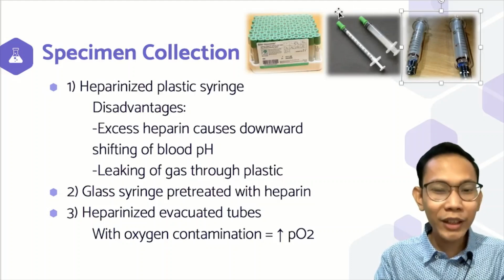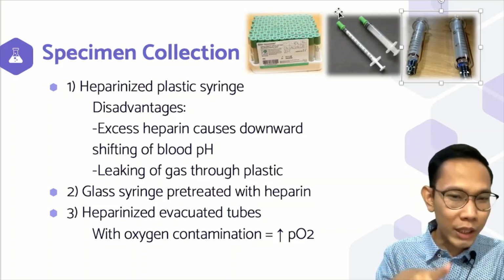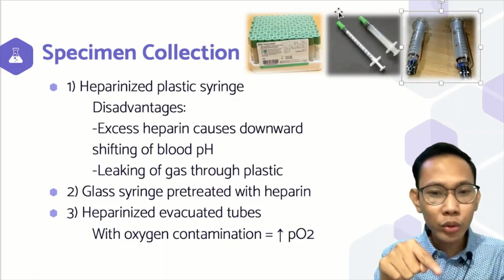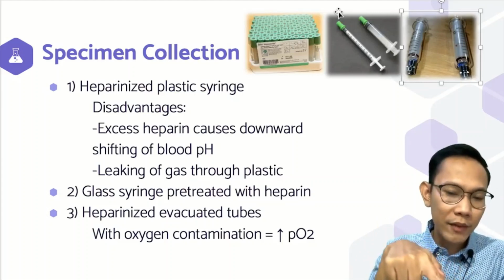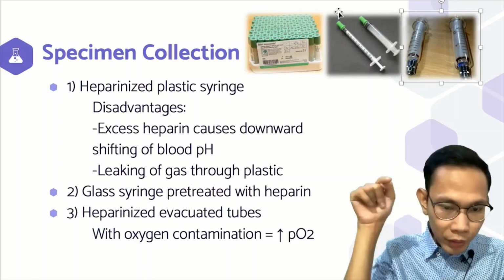Again, we are not trained to do arterial collection. Usually it's a very different technique, no? Usually, di ba, pag venipuncture, pero makonti lang ang angle. Pag arterial puncture, usually, tinataas namin. It's not totally 90 degrees, no? Sometimes, nasa 45 and above. Depende sa location. And then, you have to really check.